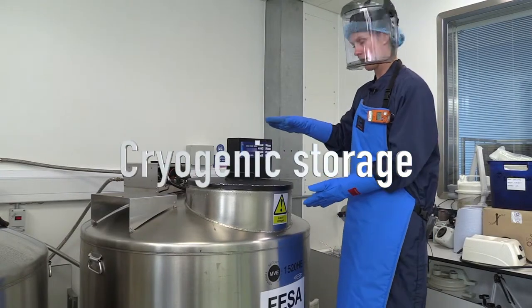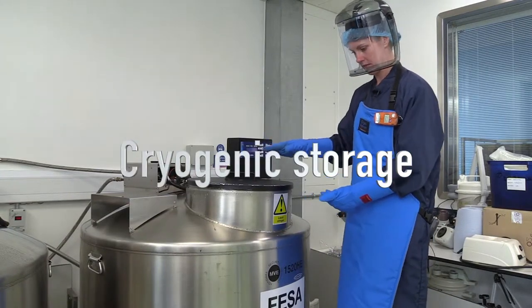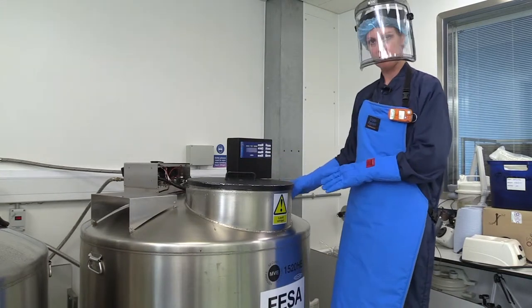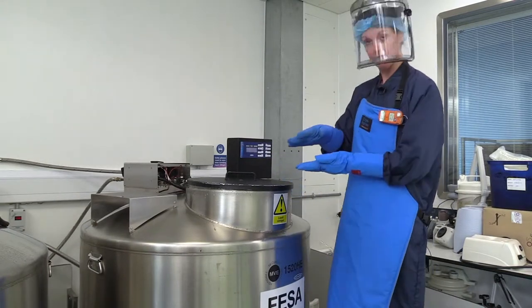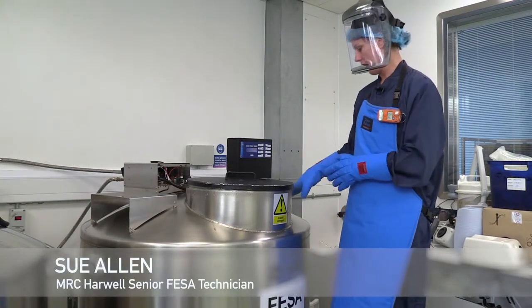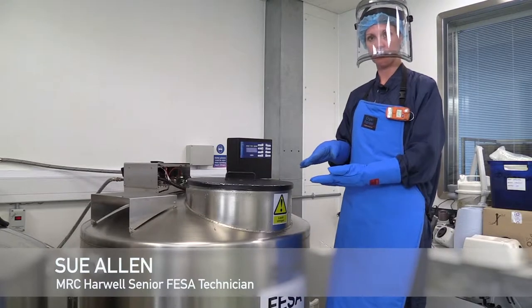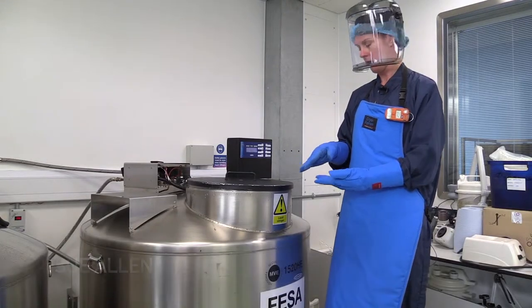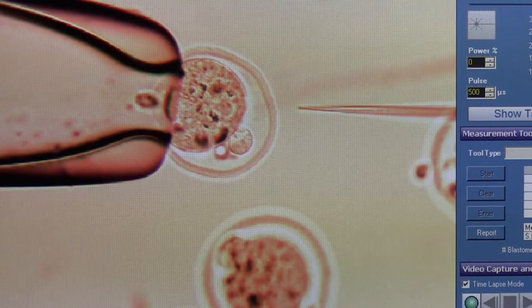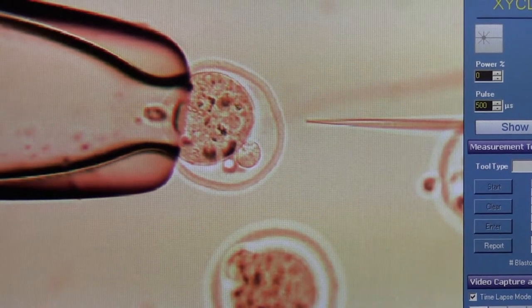This is a liquid nitrogen bulk tank. This one in particular has just a couple of inches of liquid nitrogen in the bottom, and the samples are stored in the vapour phase — it's still really cold. We store embryos and sperm, and we can also store ovaries as well.